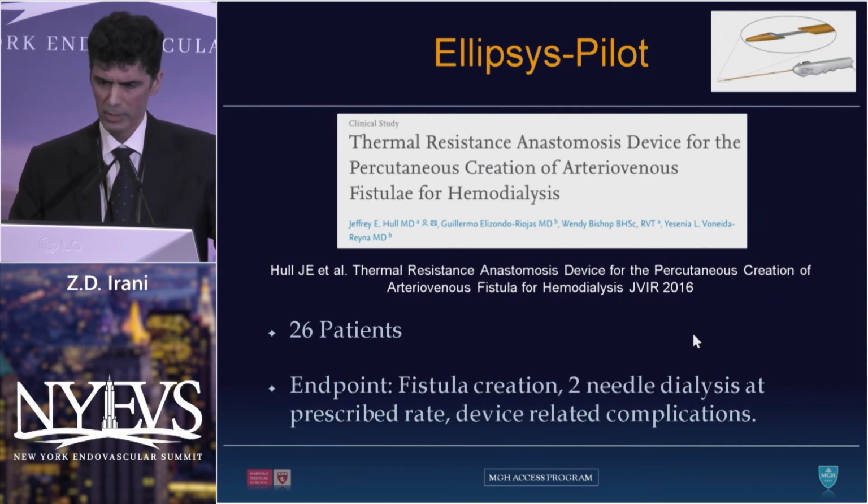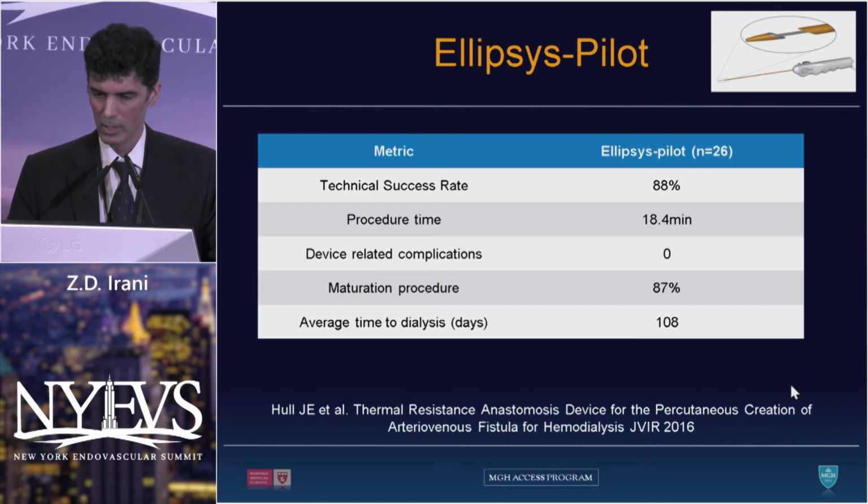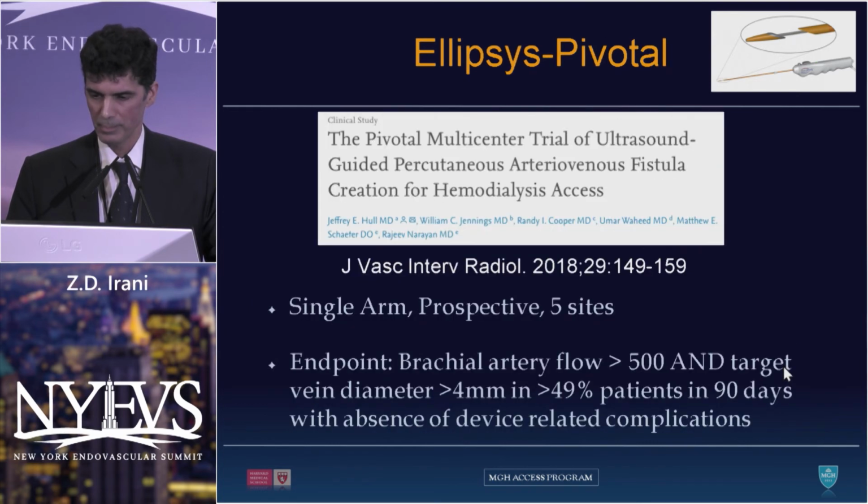So the pilot study done for this device, 26 patients. They again looked to see if there was a way to create a connection that was safe, and also the fistula ultimately, whether it was able to be used for dialysis. And they proved all those points, all the boxes were checked. And interestingly, procedure times are real quick. And the maturation for these fistulas needed an adjunctive procedure 87% of the time.